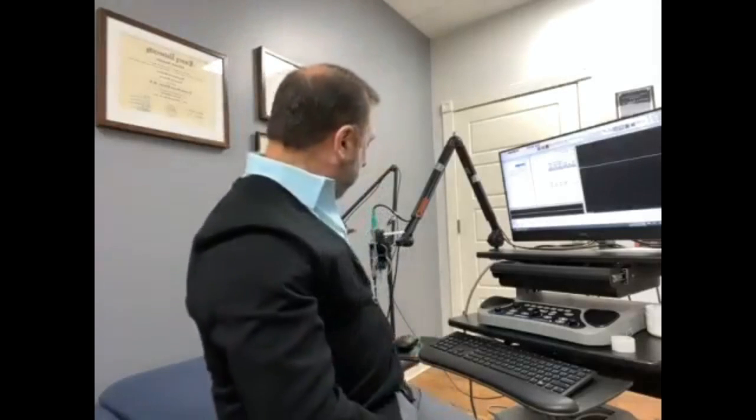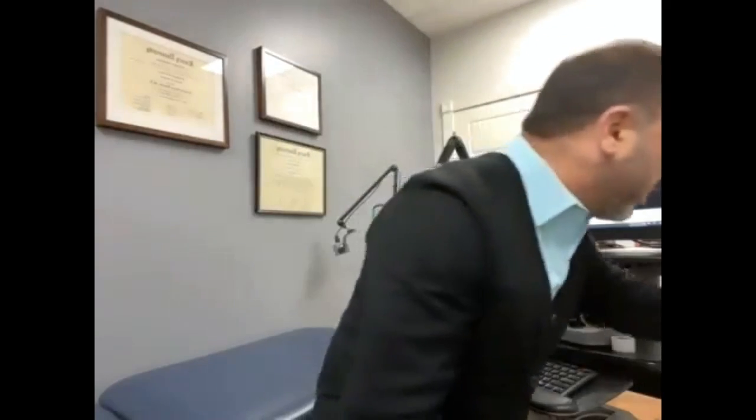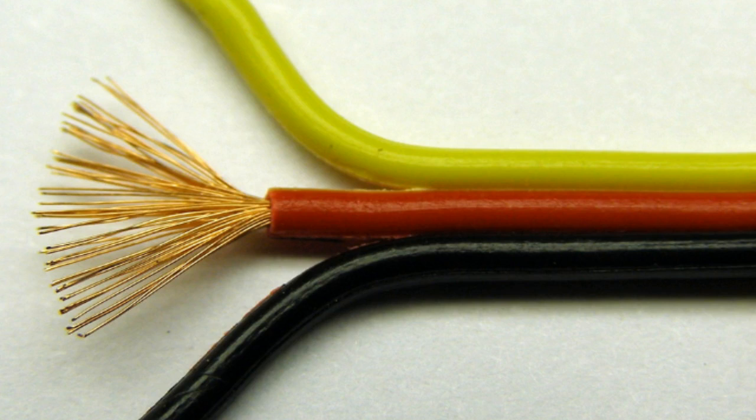Okay, so how does this work? Well, first of all, I'm going to take a wire, and if you're watching this on video, you're going to see a green wire. This is actually a ground wire used in nerve conduction testing, but I'm using it to make a point. If I were to take a pair of wire cutters and just cut this, and you can think of an electrical cord at home, it'd be the same thing. What would you see inside? You would see at the center the metal, that is the wire itself. And then around the wire is rubber. Now here, this rubber or plastic is an insulator.